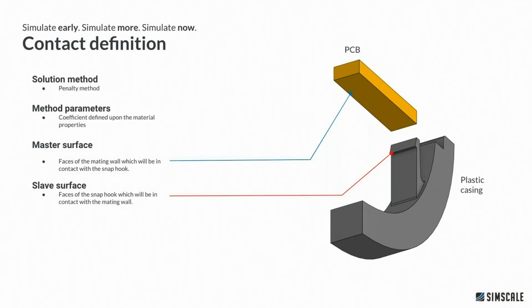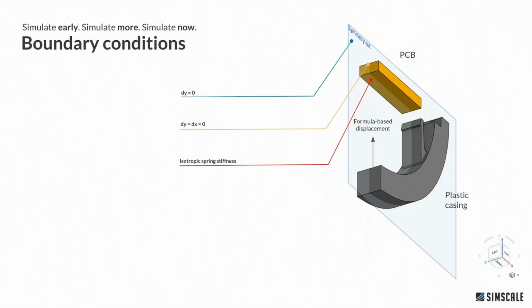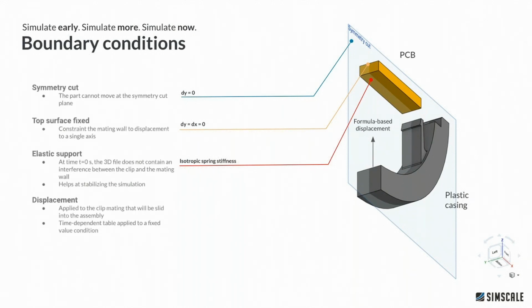About the master surface, it's going to be defined as the electronic board, while the moving part will be the plastic clip. So the plastic casing is going up towards the PCB. And then we'll have 4 boundary conditions. To ensure that the plastic part will move, we'll set a displacement formula for it or a table formula for it. And to keep the electronic board fixed, we'll assign its top surface to a fixed value condition. Finally, we will also cut this part, this 3D model in half, as we can simplify this problem to a symmetric geometry. This would lower significantly the runtime and reduce the computational cost of the simulation.